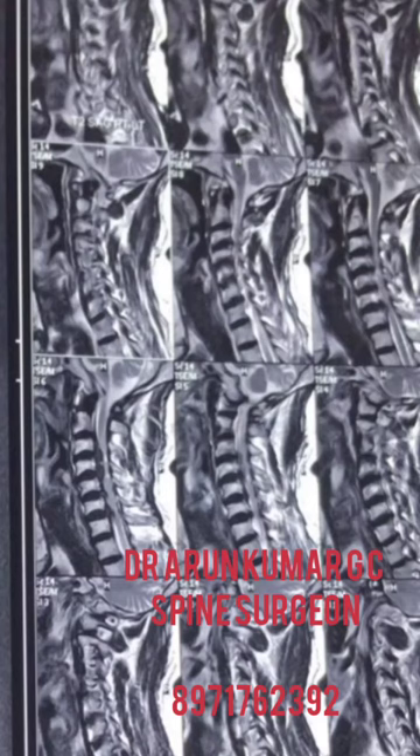Hi, myself Dr. Arun Kumarjisi, Orthopedic Spine Surgeon, Bangalore, showing you an interesting case of ossified disc C3-4, C4-5, C5-6, C6-7 with myelomalacic changes in the cervical spinal cord.